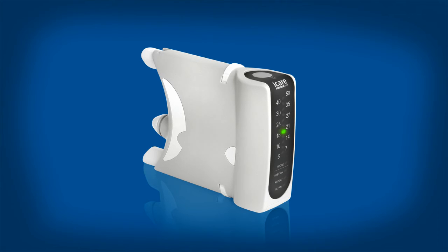To switch off the tonometer, press the measurement button until all the lights switch off and the probe comes out. If the tonometer is not used for three minutes, it will automatically switch off.